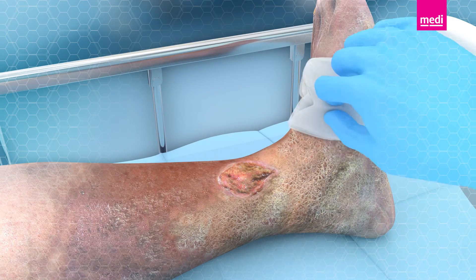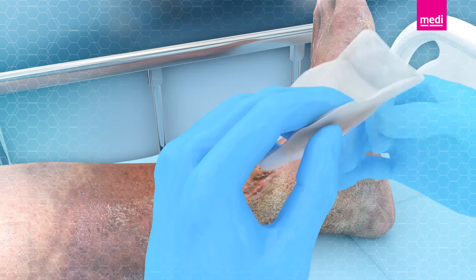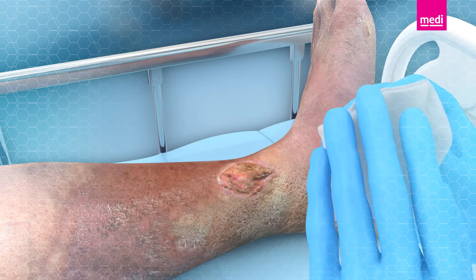The non-woven viscose cloth is effective in debriding wounds, whilst the solution cleans and hydrates the wound bed and the perilesional area.